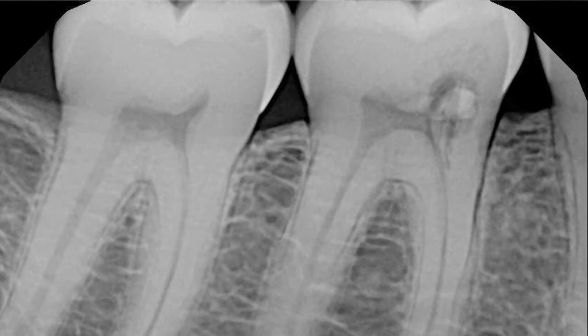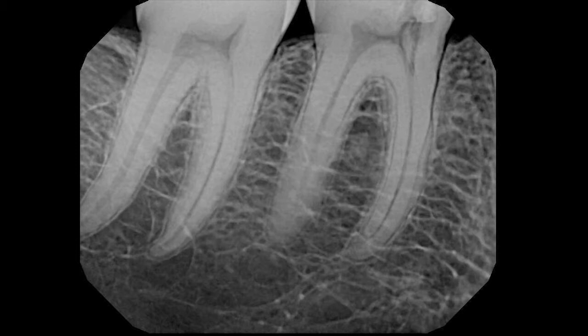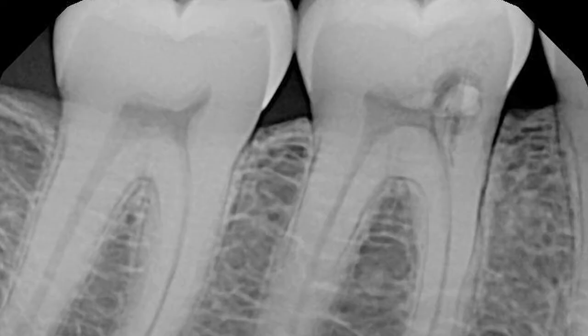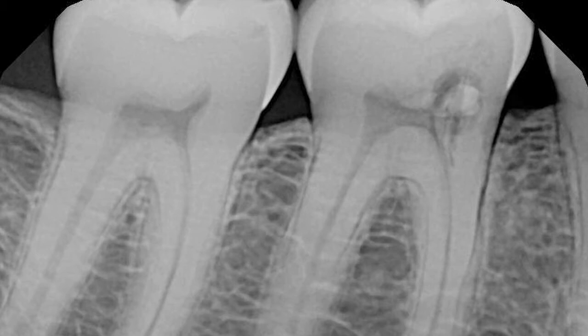Here is the tooth from another angle. The resorptive defect was noticed during a routine hygiene visit by the patient's general dentist. The patient experienced pain when an explorer was inserted into the defect and bleeding was induced. It was diagnosed as a perforation defect caused by a pulpal extension of an invasive cervical root resorption in the coronal pulp. The defect was immediately repaired with a small amount of EndoSequence root repair material by the patient's general dentist and the patient was referred for endodontic therapy.